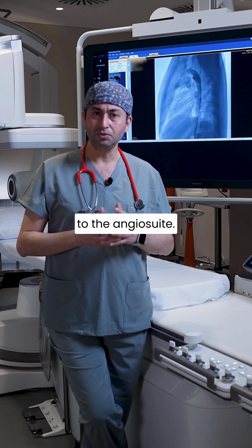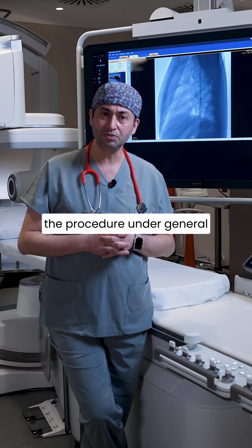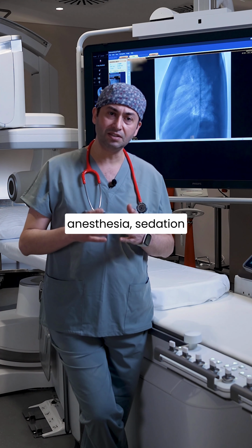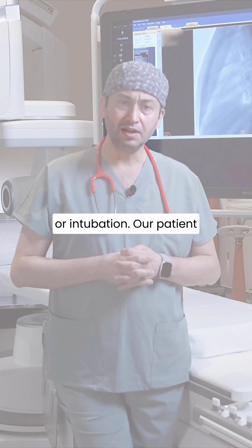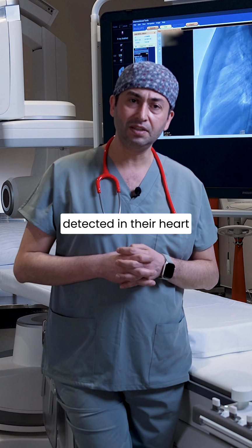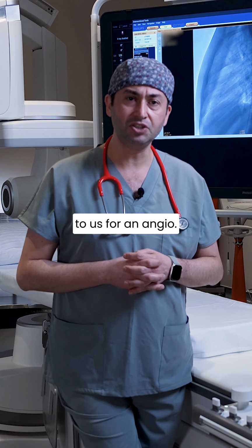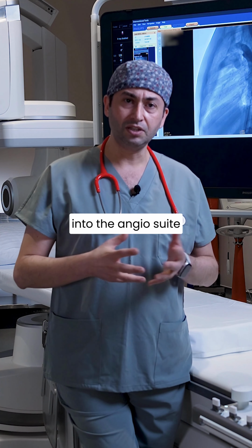Next, we take them to the angio suite, and since our patients are young children, we usually perform the procedure under general anesthesia, sedation, or intubation. Our patient here was one such case. This abnormal structure was detected in their heart at around 6 to 8 years old, and they were referred to us for an angio. We brought our patient into the angio suite.